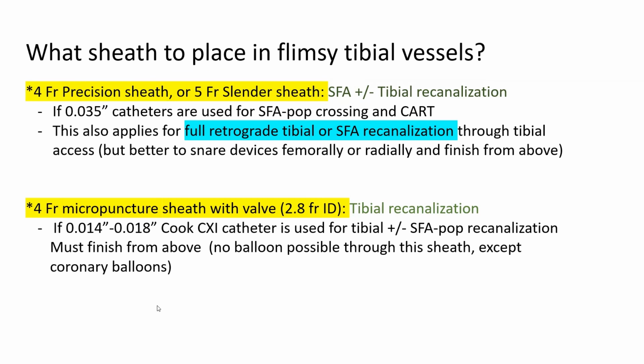You tend to push so much, and I think by doing all those maneuvers, you end up injuring the entry site through your pushing. You end up probably, theoretically, injuring it more than putting a sheath. There is a theoretical risk of tearing that vessel with your push. And actually, not just a risk of injuring the vessel across its length, that tibial vessel, not just at the entry site, because you're pushing with no support to stabilize your sheath, your catheter at the entry site. So I do hate not using a sheath, and I steer away from it.